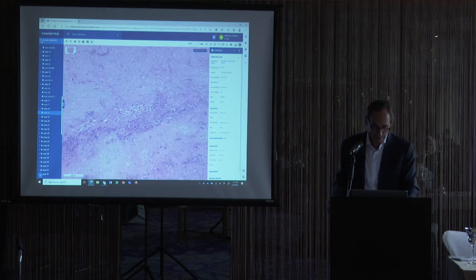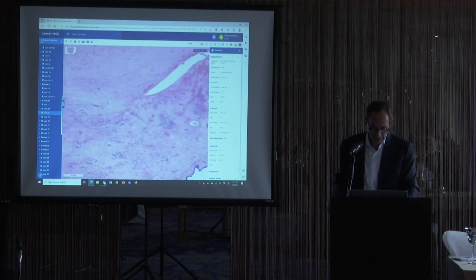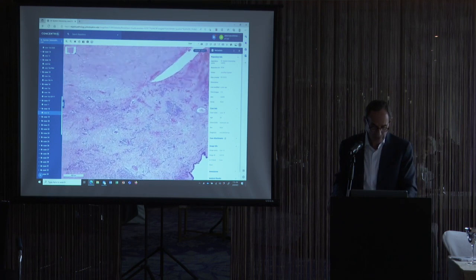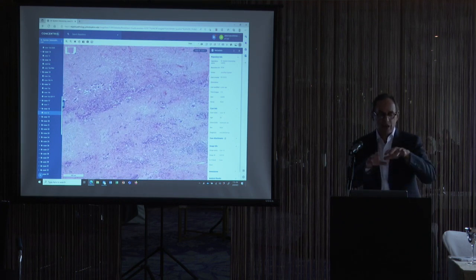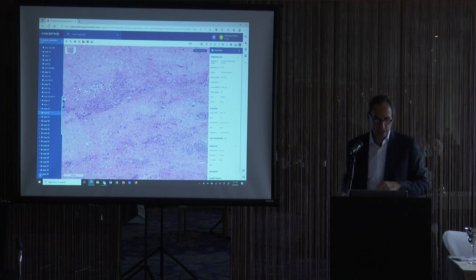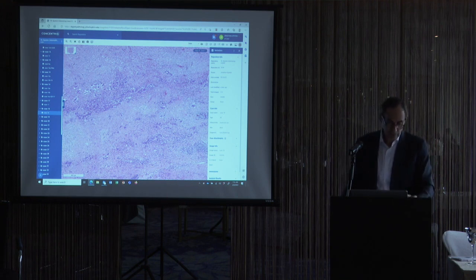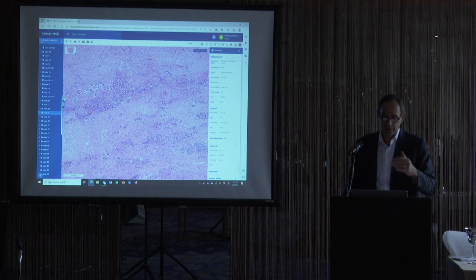But again, I think most of the time it's the morphology that's helpful, that it's just this linear proliferation of glands, whereas in malignant mesothelioma, the tubules tend to go down irregularly into the stroma. They tend to go down into the fat and not form this nice organized linear row of glands. The other thing I find helpful when you have a hydrocele with these is put through more, because often we just put through 1 to 2 sections, put through more just to make sure nothing looks worse on additional sections.